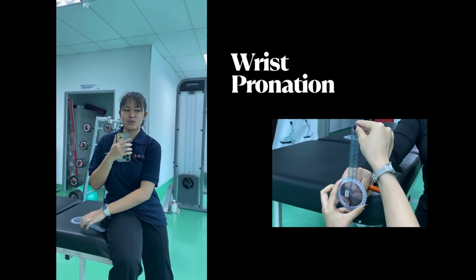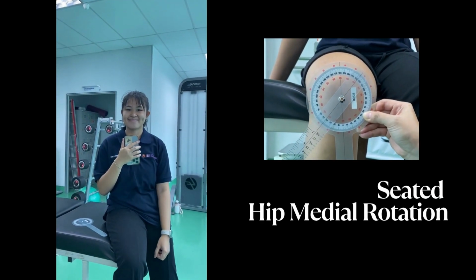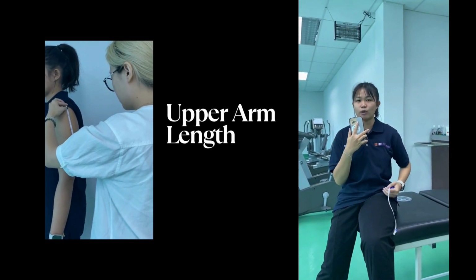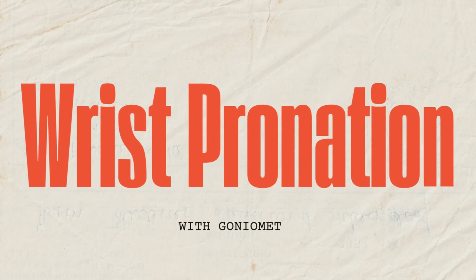Today we're going to demonstrate 4 assessments. With the goniometer, we're going to demonstrate wrist pronation and also hip medial rotation. And as for the measuring tape, we're going to measure the upper arm length and also the leg length discrepancy. Let's begin with the first movement, which is wrist pronation.